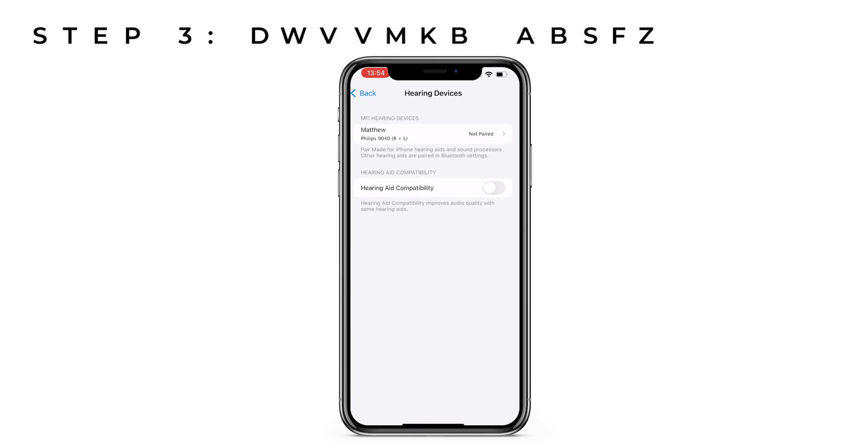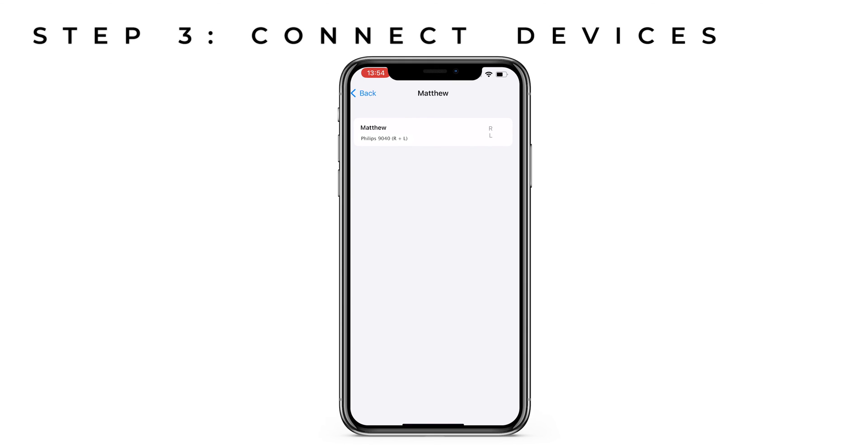Your name should now appear on the top of the screen alongside the model of your hearing aid. You'll see an R for your right hearing aid, L for your left hearing aid, and R plus L if you wear a pair of hearing aids. When your complete setup has appeared, click on your name and you should be prompted to pair with your setup. You'll see a single box appear if you wear a single hearing aid, or two if you wear two hearing aids. Press pair and you should be connected.